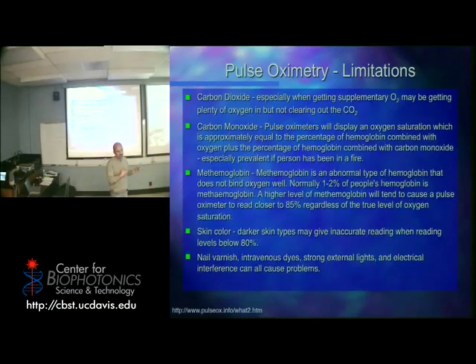So I'm not measuring CO2. If I wanted to measure CO2, I'd have to find something that the CO2 binds to that causes some kind of color change. Otherwise, do we see CO2? It doesn't have any optical properties in the visible range. There are other wavelengths we can use for CO2, but it gets much more complicated. So the easiest thing to measure is bound oxygen, because it causes a relatively dramatic change in the hemoglobin. That's why we measure that. Ideally, we would measure a whole bunch of other things.